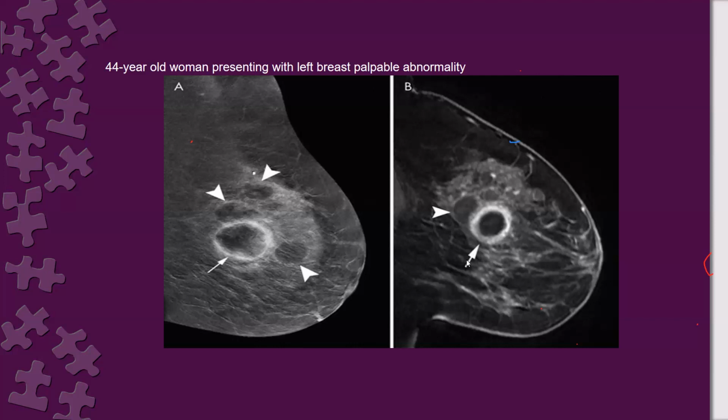This is on MRI. Sometimes we look at other characteristics, but with just contrast enhanced mammography, because we see it on the low energy image as opaque, we will not be sure if it is soft tissue or cyst. Without correlation with ultrasound, it will be difficult to evaluate or comment on ring enhancement.